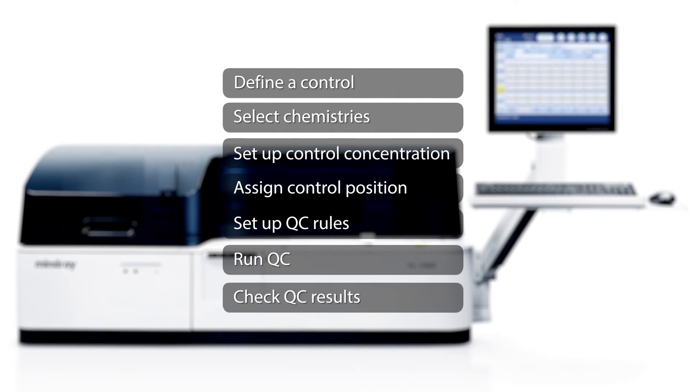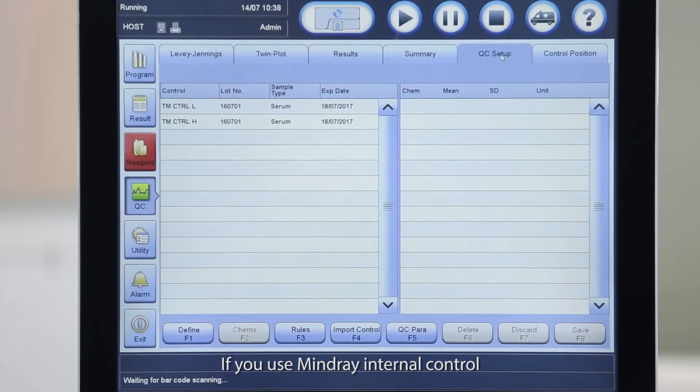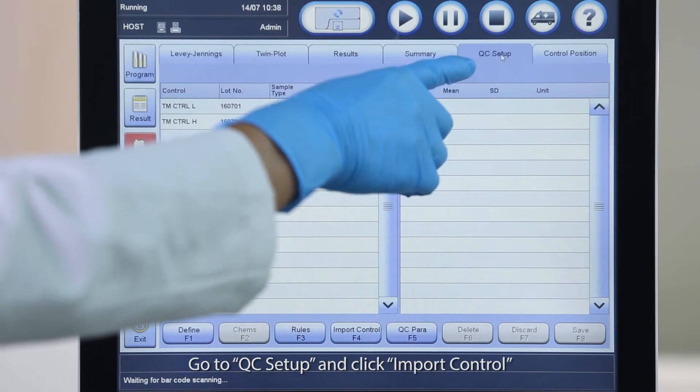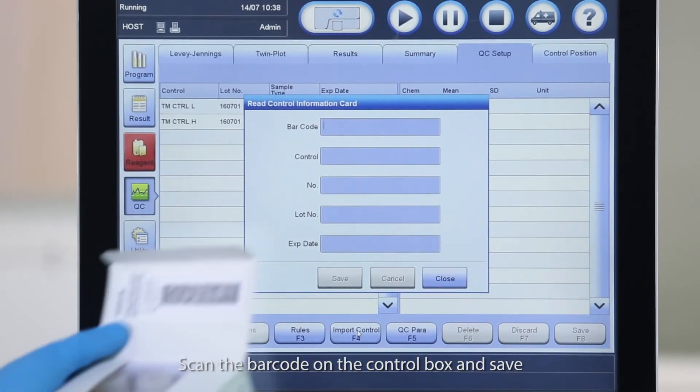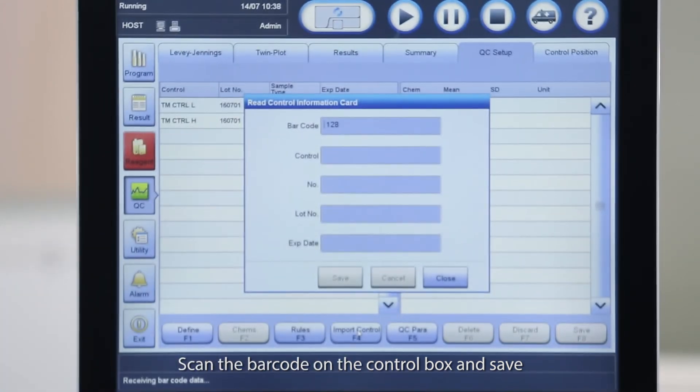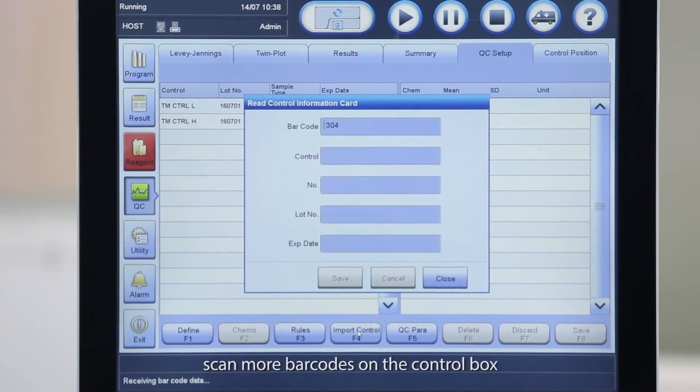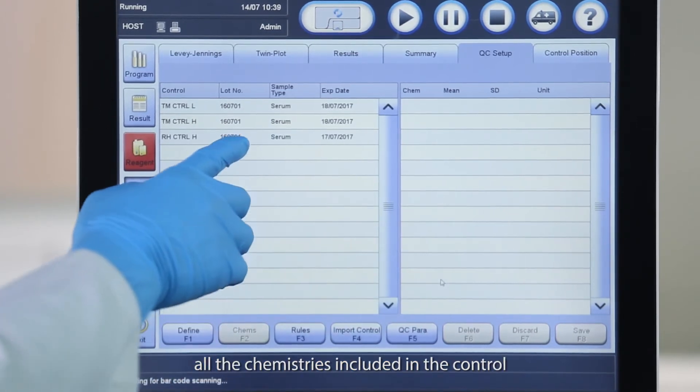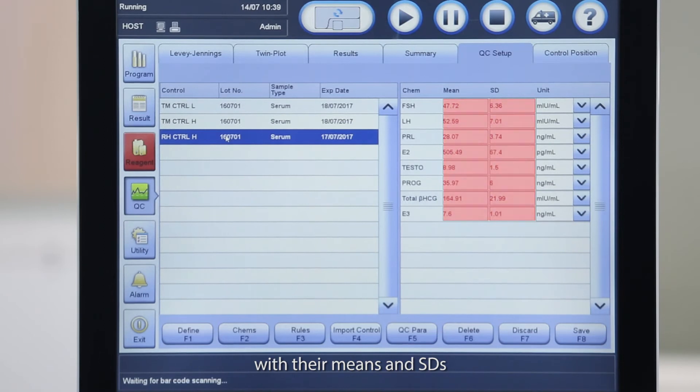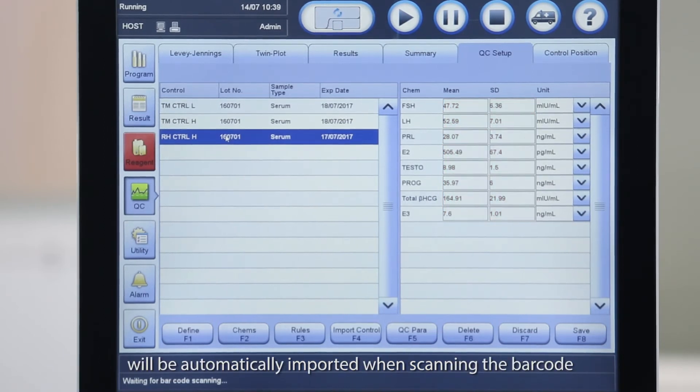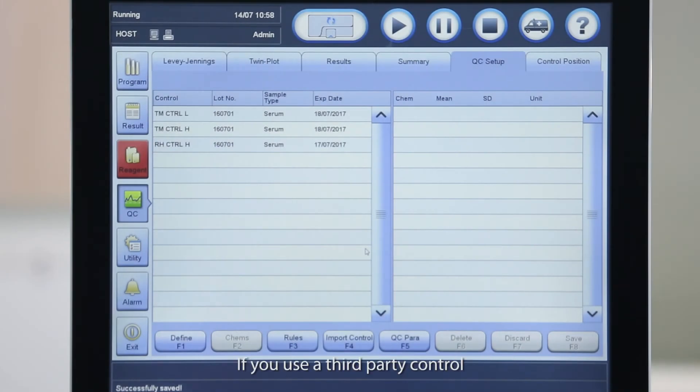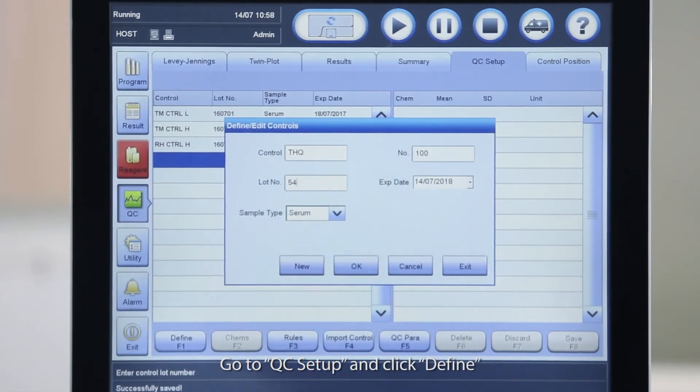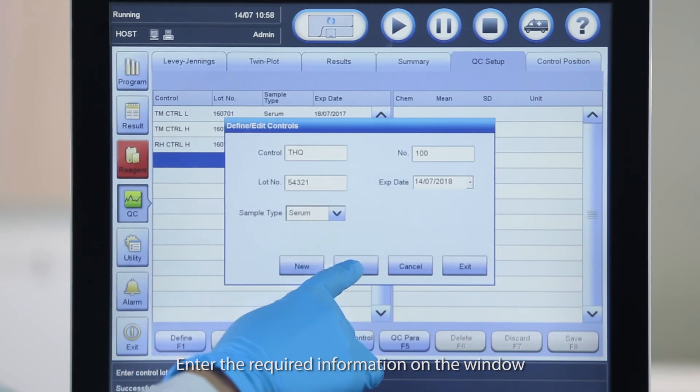If you use Mindray Internal Control, you can define the control by simply importing the QC information. Go to QC Setup and click Import Control. Scan the barcode on the control box and save. To define more controls, scan more barcodes on the control box. For Mindray Internal Control, all the chemistries included in the control with their means and SDs will be automatically imported when scanning the barcode. If you use a third-party control, you can also manually define it. Go to QC Setup and click Define. Enter the required information on the window.